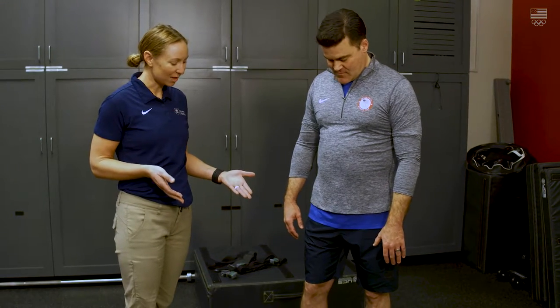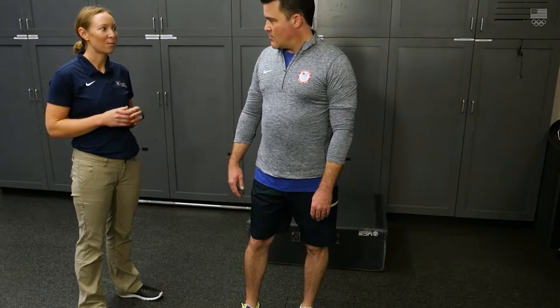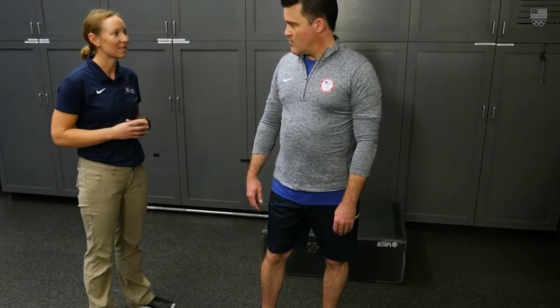We are going to do some testing with the force plates. We have two force plates so that we can individually measure what your left leg is doing versus your right leg. We need to measure if our athletes have imbalances, so when we're returning them from an injury back to sport, we like to see how their injured leg is doing compared to their non-injured leg, and also for performance enhancement to make sure that they're symmetrical.